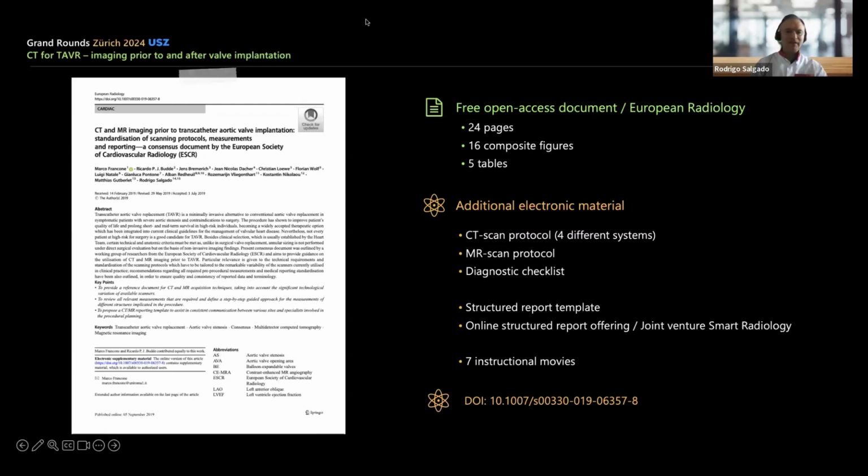No. The thing that we can say at this moment is when you have a bicuspid valve, you should report it because it increases your chances of having more conduction disturbances after the implantation. I think the surgeon and the cardiologist have to be aware of that. I'm not sure if it's going to change their approach. I think the manufacturers are also aware of this problem, maybe working on solutions. But at this moment, besides the fact that we must report that we think the valve is bicuspid, there is not any more information that we can give regarding the potential problems that may arise.